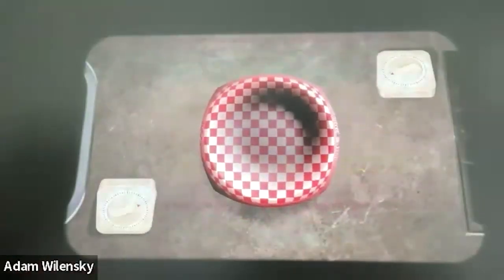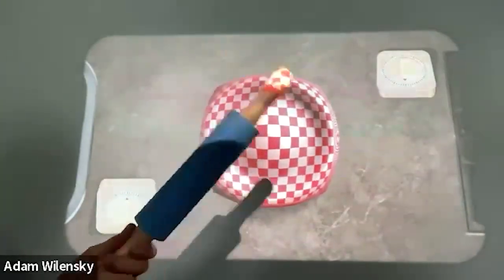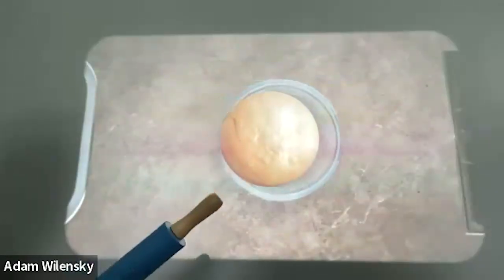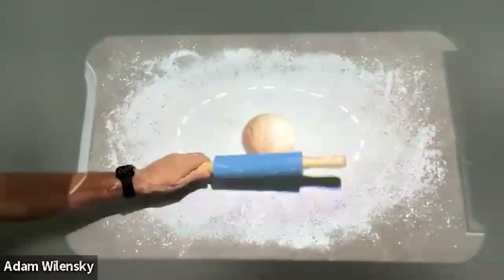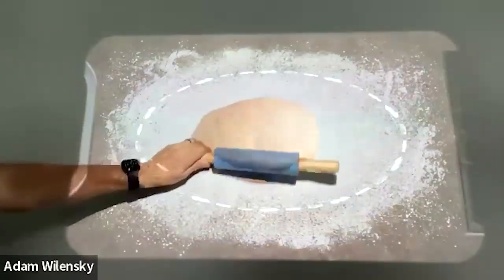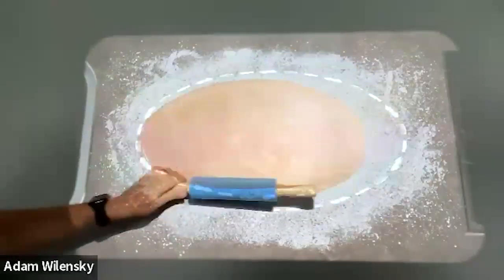And then what I'm going to do here is apply a slightly heavier weight-bearing prop. In this instance, this is your standard rolling pin, but it's got a nice vinyl bottom. And so I can take this rolling pin and I can actually knead the dough just like that. It's going to give me that nice bilateral motion.